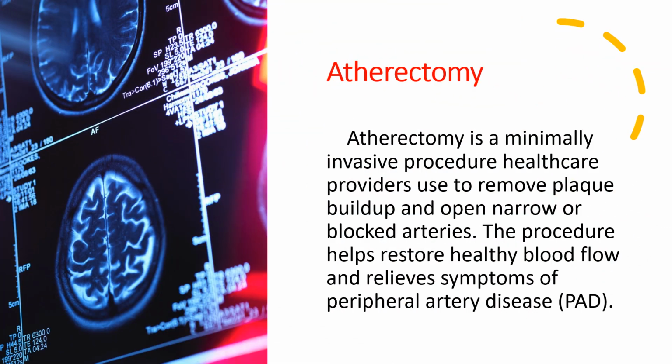So atherectomy is a minimally invasive procedure. Here mainly the cardiology healthcare provider will be removing the plaque which has built up and is narrowing or blocking the arteries, so that it helps to restore normal blood flow and relieve symptoms.